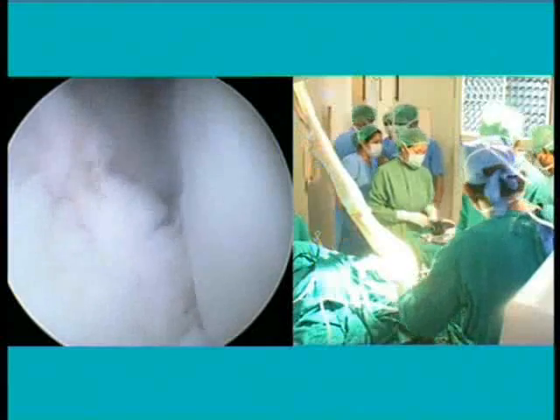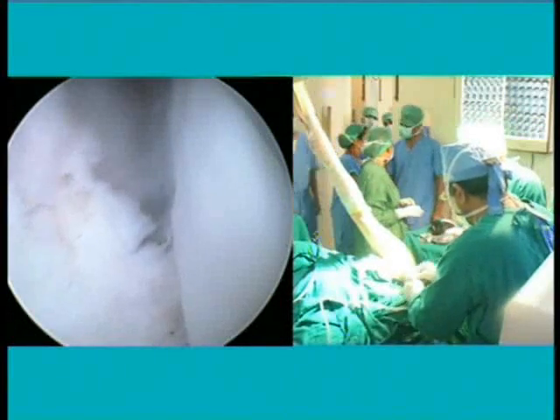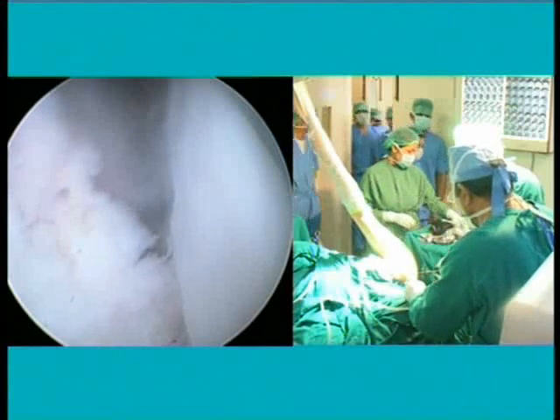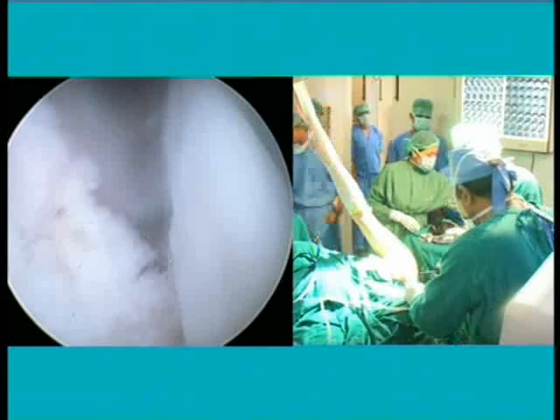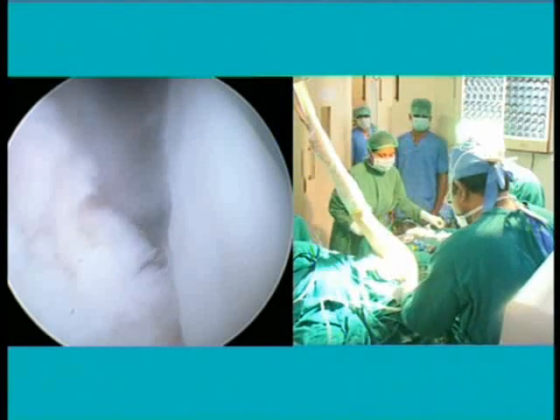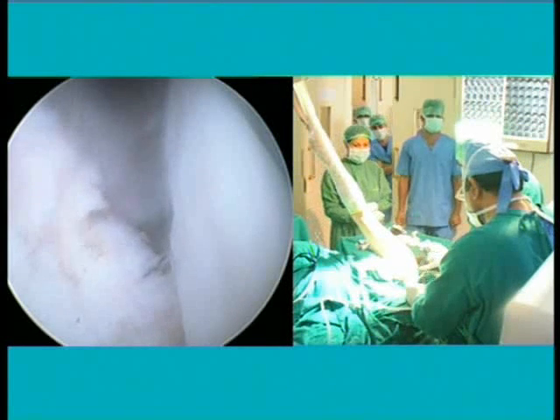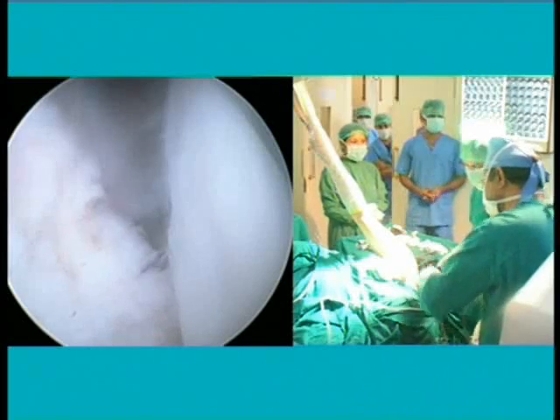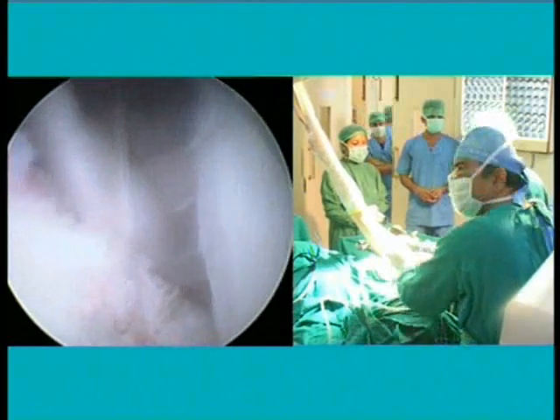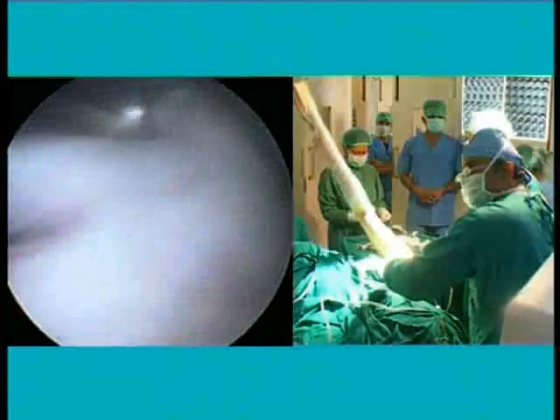The tissue that comes out has to be made into a post. It is very easy and very low profile. The idea is that this is basically a railroad wire, whatever implant we are passing. If we are using a TightRope, we have to pass it from the clavicle to the coracoid. In this case, we are using the dog bone washer, and you can see how it looks.